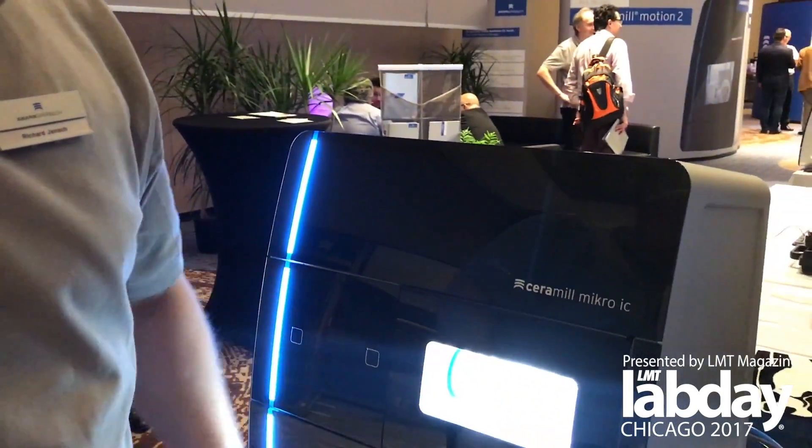Hi, I'm Richard from Gerbach. I'm going to give you a quick rundown on our new machine, the CERNAL Micro IC, which is a four-axis wet mill.